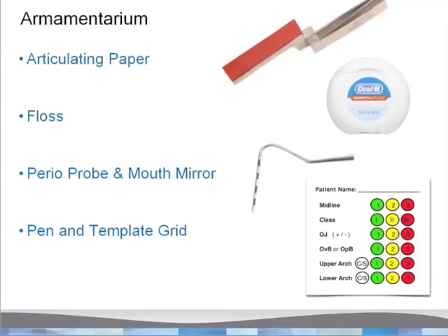In fact, we believe that using this template grid will become part of the normal Heartland Dental Care new patient exam, where while the hygienist is doing their full mouth periodontal charting, they'll simply use the probe, make these 6 simple, quick assessments, and alert the doctor to the potential for treating malocclusion for this patient. And so let's look and see how this is all going to interrelate.